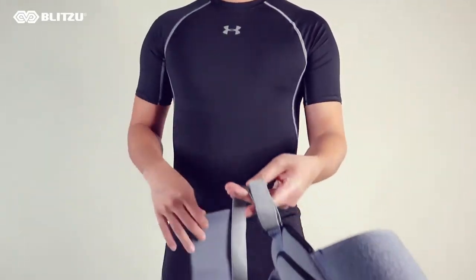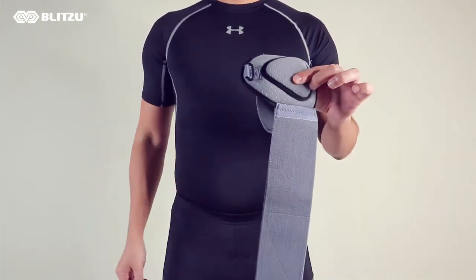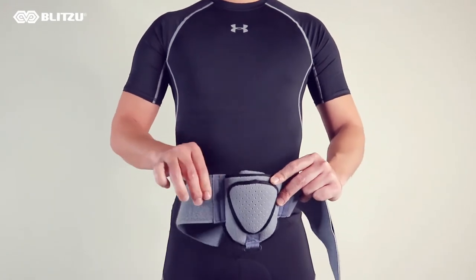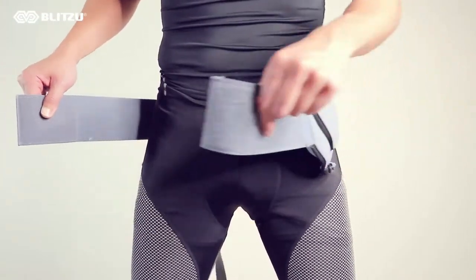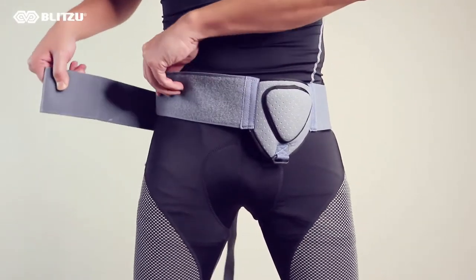To apply, start with straps fully loosened. Put the compression pad inside the pocket. Position the waistband at hips and line up the pad with where you want the pressure to be applied.